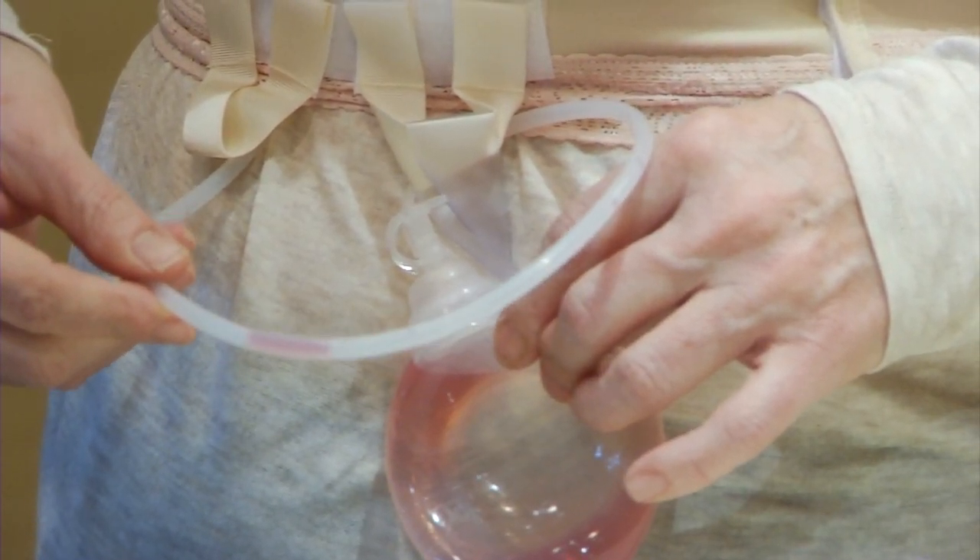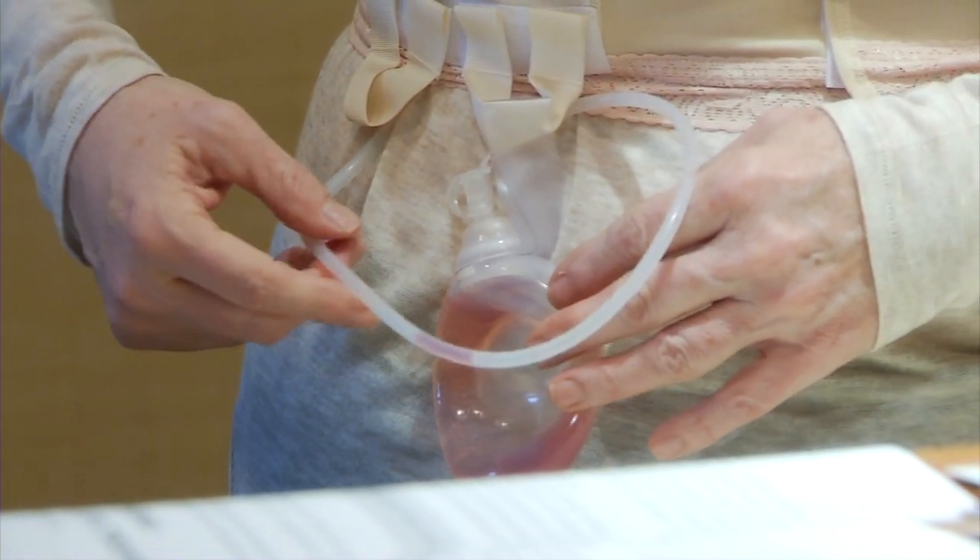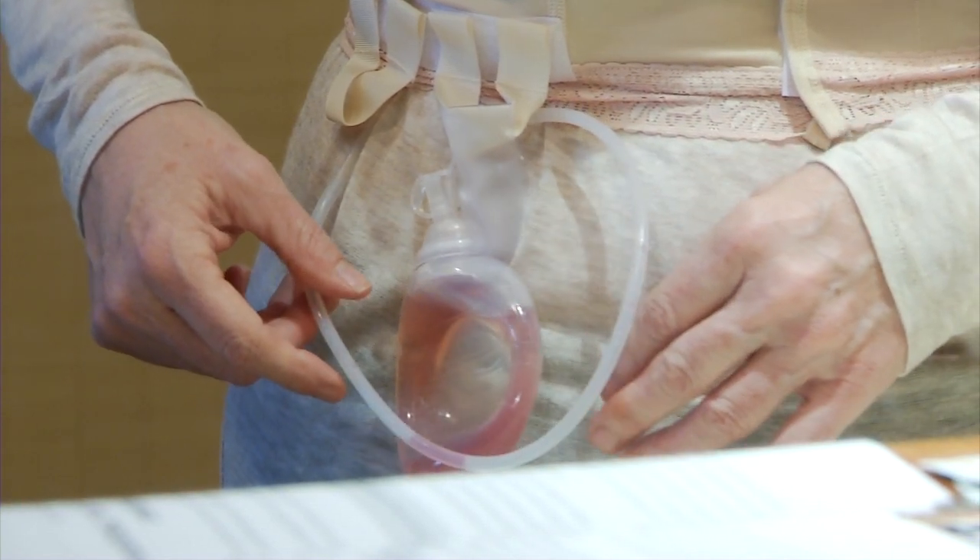There are two parts to your Jackson Pratt drain: the tubing and the bulb. Before you empty the drainage bulb, you'll need to milk the tubing so it can drain properly.